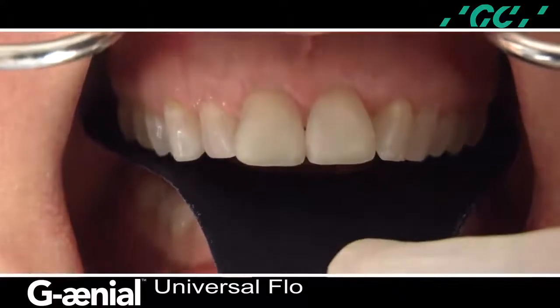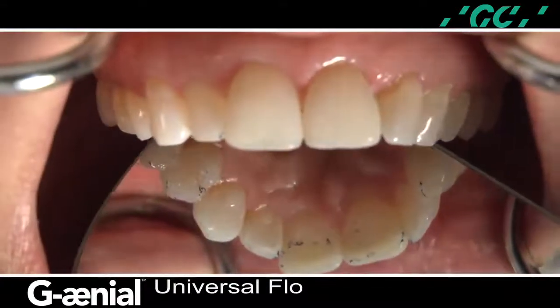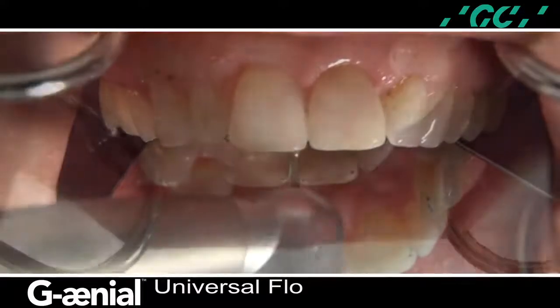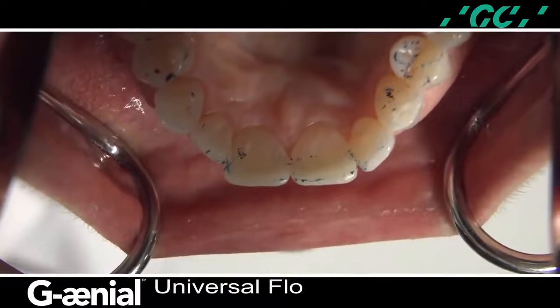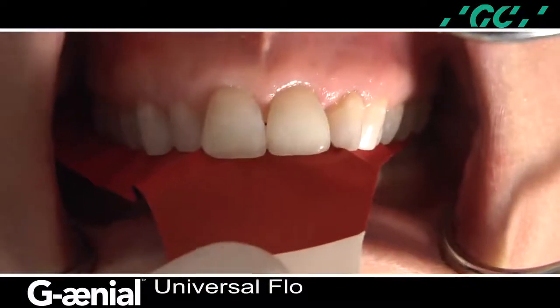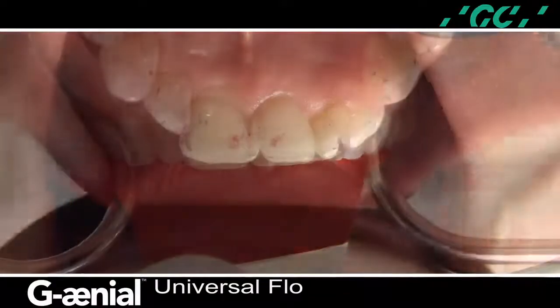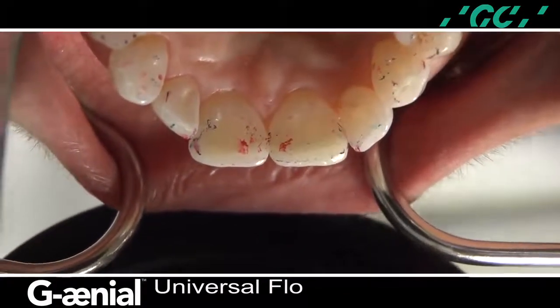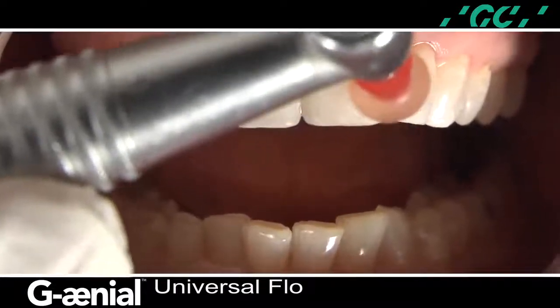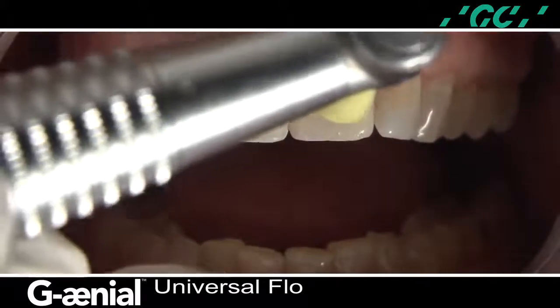The occlusion is inspected with the patient in an upright position in centric occlusion and inspected for any prematurities. Prematurities can be equilibrated using the pyramidal-shaped finishing bur, an H-274 by Brassler — this shape conforms to the appropriate curvature of the tooth surface and the restoration. Notice the seamless interface. The patient performs protrusive and lateral excursions and the transitional restorations are inspected for prematurities. The incisal edges and facial surfaces of the composite restorations are precisely finished to obtain a smoother surface with a fine finishing disc, an ET composite polishing disc by Brassler. The gingival and facial region is smoothed and polished with a high-shine silicone cup, a Composi Pro One-Step by Brassler. The hollow cup provides additional flexibility at the cervical curvature of the tooth.